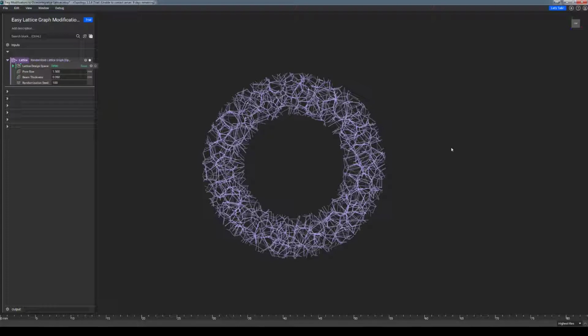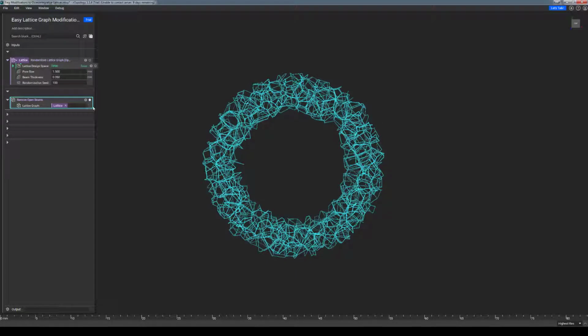But with a few other custom blocks, I can show off some of the modifications that a user might be interested in applying to a lattice structure after it has been created. The first one here is Remove Open Beams. Now this one is really cut and dry. If I drop in a lattice graph as an input, what this does is remove every single exposed beam in the lattice.